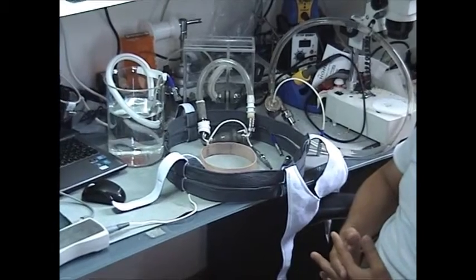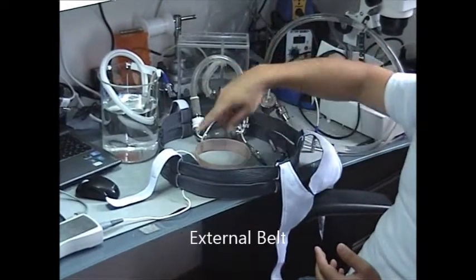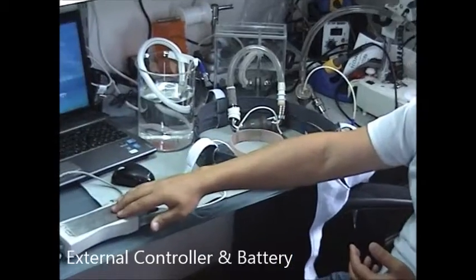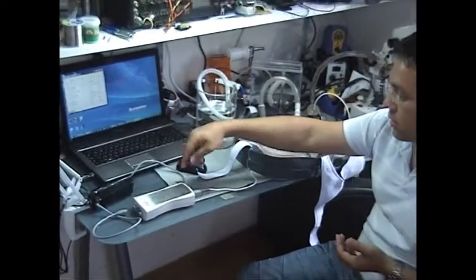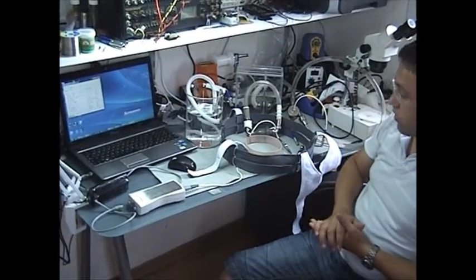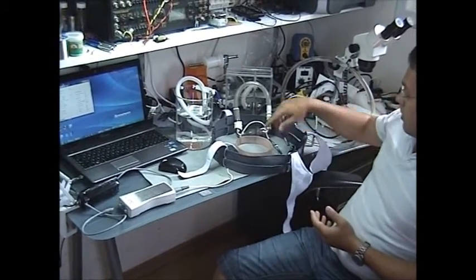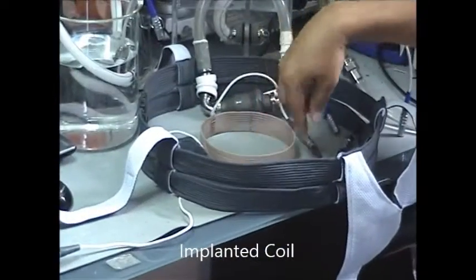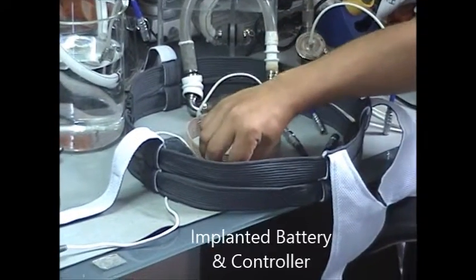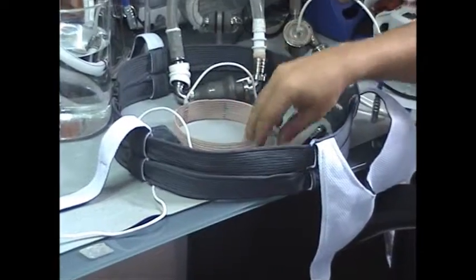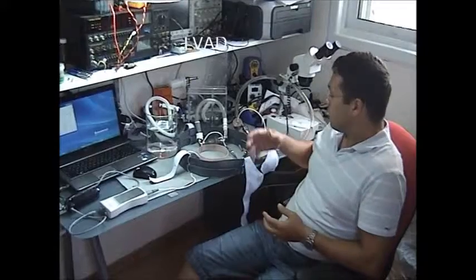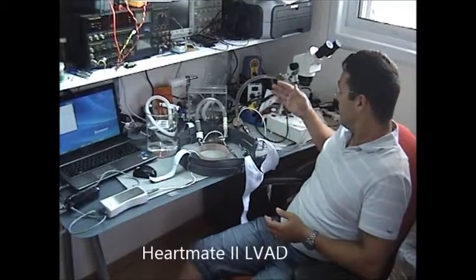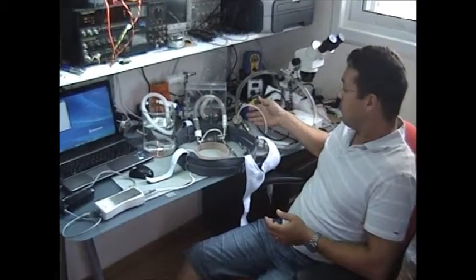Leviticus cardio system consists of the external belt, external controller and external battery connected via USB cable to the computer, and the internal part of the system consists of the internal coil, internal battery, internal controller and the VAD itself. Compatible VADs include Torotec HeartMate 2, Cleveland Clinic's CoreAid VAD, Jarvik Adult VAD and Jarvik Pediatric VAD.